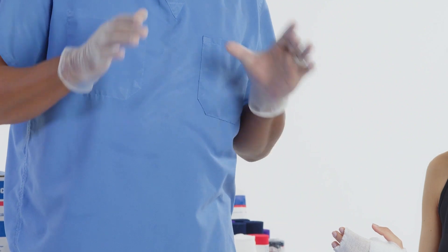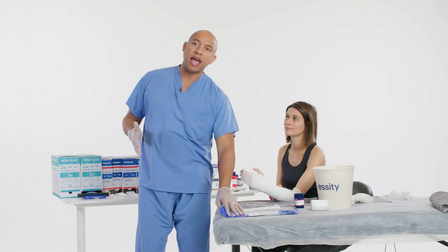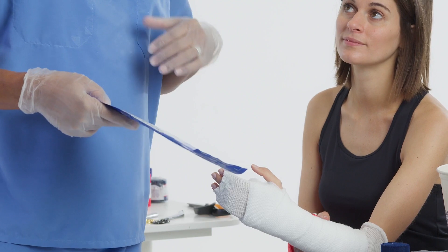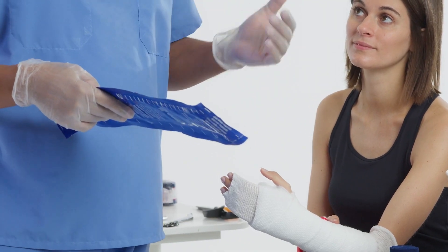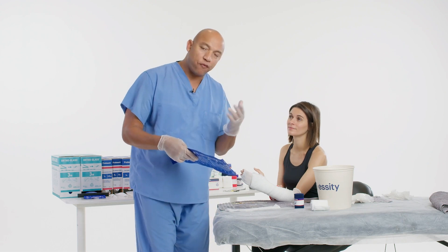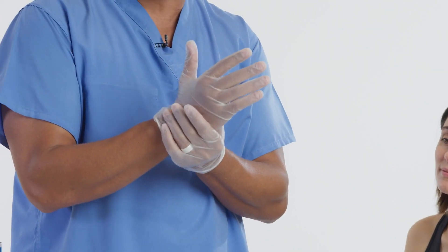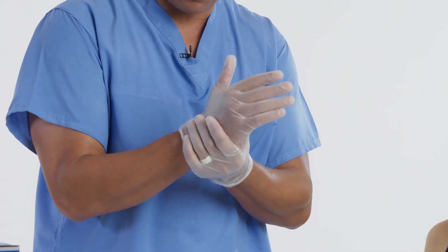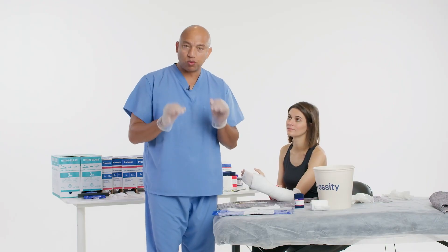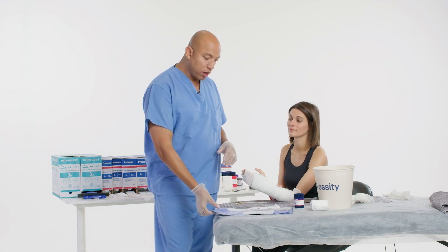We did the same exact stockinette and padding application. All we're going to do now is add Orthoglass Solo. What I like about this is that it's a thin substrate and it's going to cure so much faster compared to plaster. Plaster is going to cure — depending on the thickness — about 24 to 48 hours. Medical staff may be moving around the patient or the splint is not totally cured yet, and you may have a little bit of movement. We don't have to worry about that with this product, because it's going to get rock solid within 20 minutes.